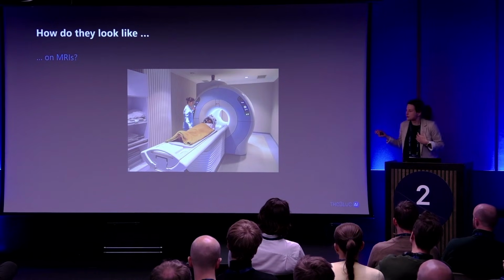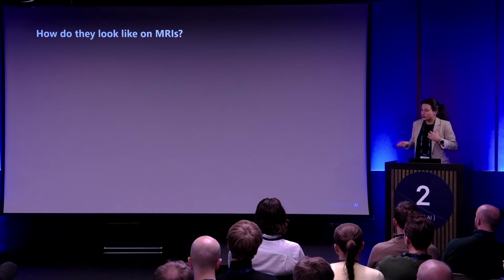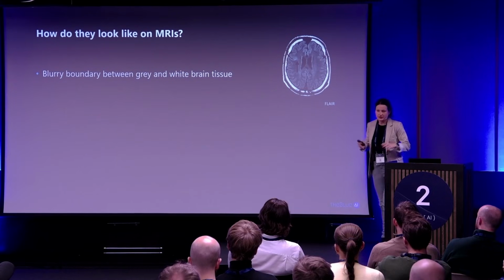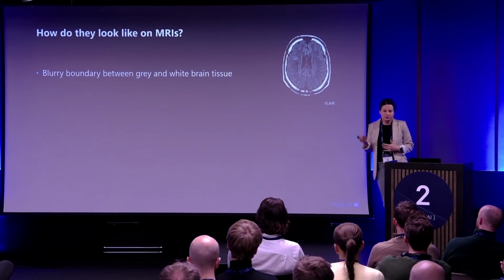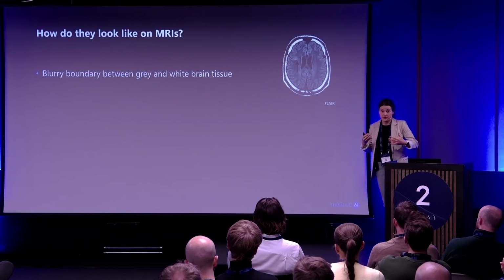So we are going to talk about it very briefly later on. So knowing what MRIs are, let's explore how FCDs look on them. There are a few different specifics. They can come in different variations, so there can be two or three of them in different combinations, but these are the most common features that help us recognize them.